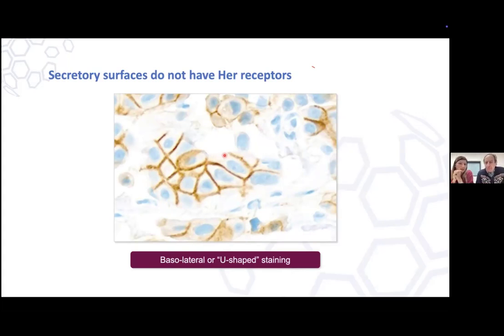And this we usually find in the micropapillary pattern. And yes, so you need to obviously marry what you see by immunohistochemistry with what you see by morphology, that's also important.